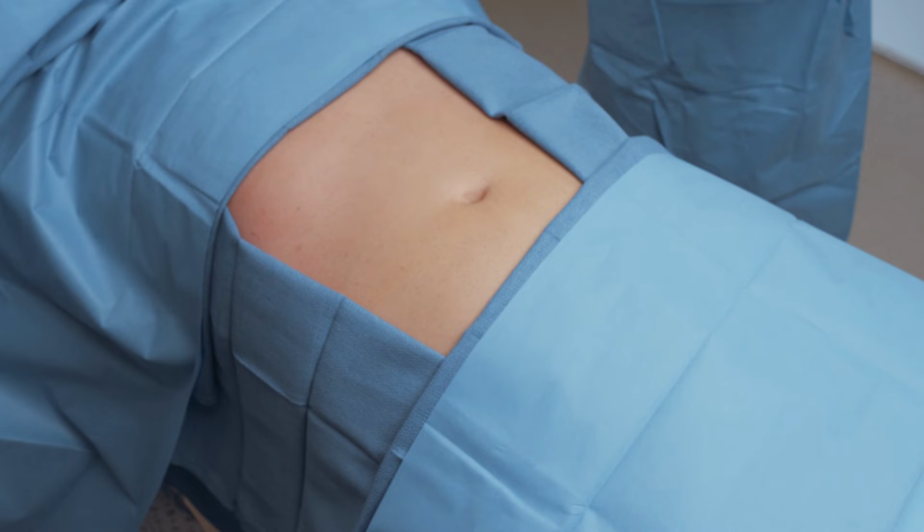Complete drying time requires a minimum of 3 minutes on hairless skin and up to 1 hour in hair. Avoid getting the solution into hairy areas. If incised drapes are being used, apply directly to the dry prepped area.